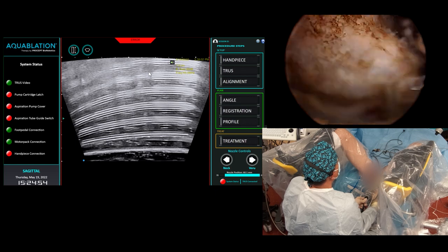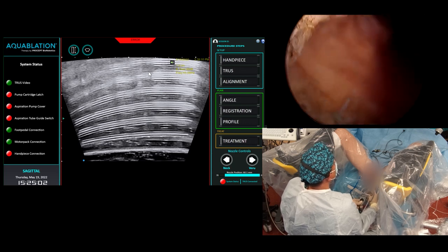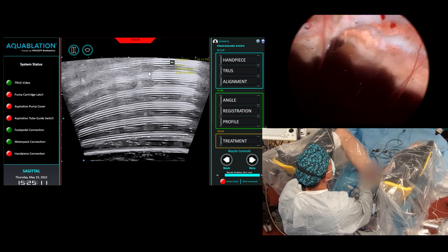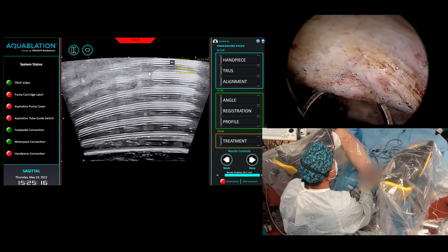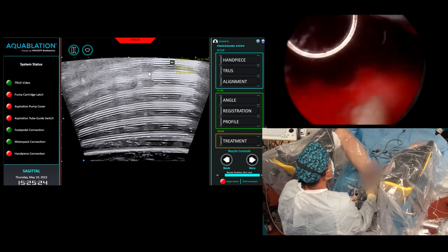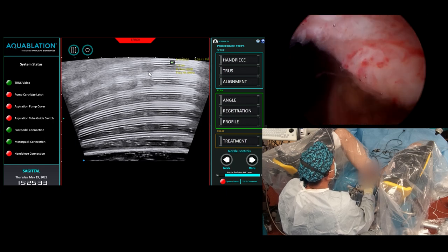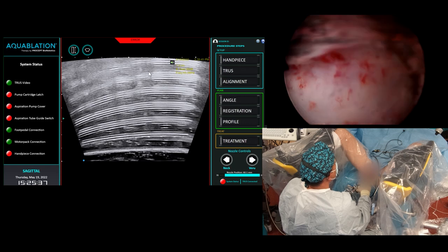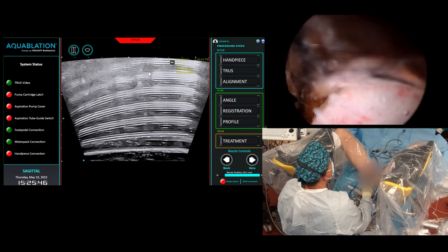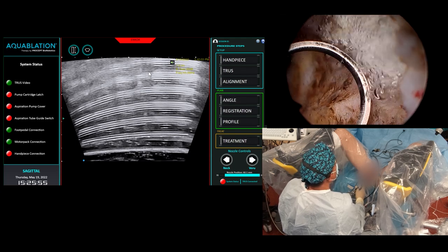The Water I and Water II study — they didn't do any of this hemostasis step and they had amazing results. So you feel like you can see how that could be a problem. They did have traction and they had good results. Viewers want to know: how do you explain this hemostasis process versus normal, just because it's a bigger gland? I do the same thing every time — I'm just spending more time. The Eurolift implants make me nervous that I'm leaving some behind. Definitely bigger glands mean bigger blood vessels. Total time so far has only been 35 minutes.